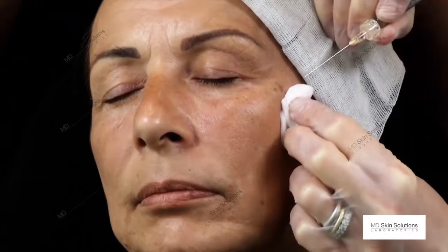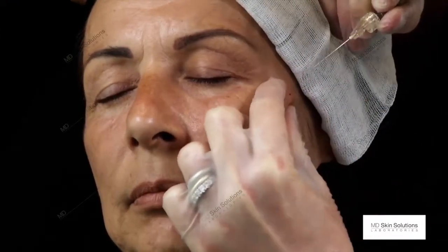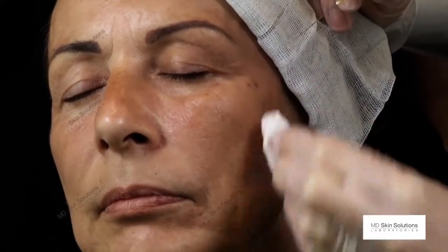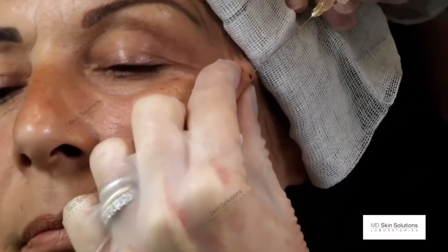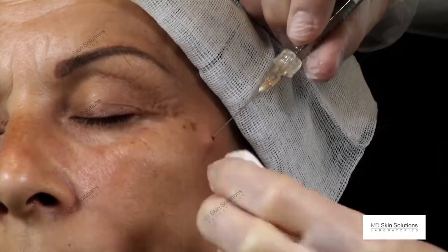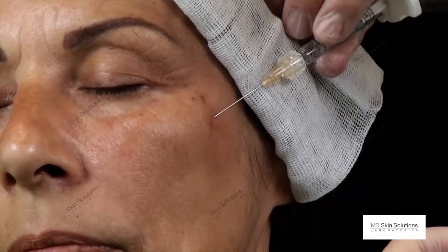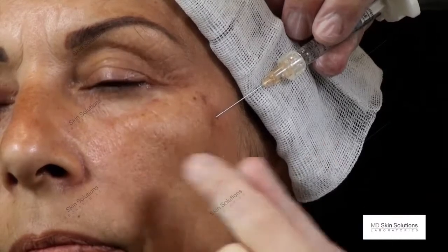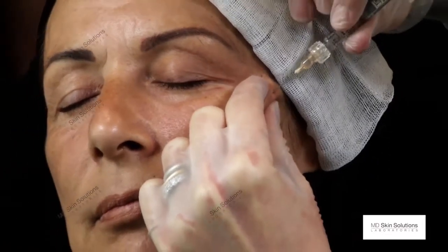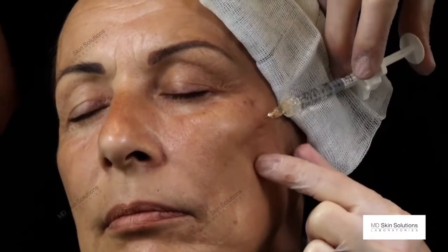Next trick is I hold the syringe like a screwdriver. I pinch the skin where I want to go deep, I insert the blunt tip gently, and now I advance the cannula in the direction of the cheek apex point, again by pinching the skin, pointing down to the bone and advancing gently.